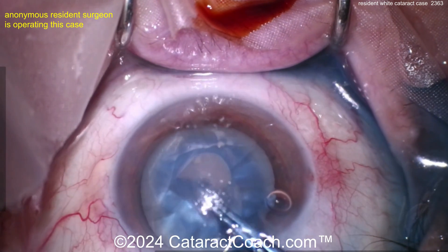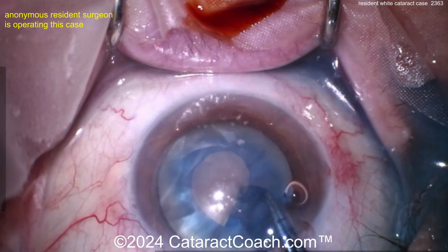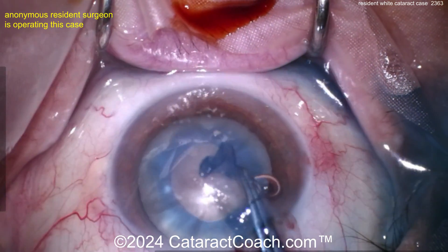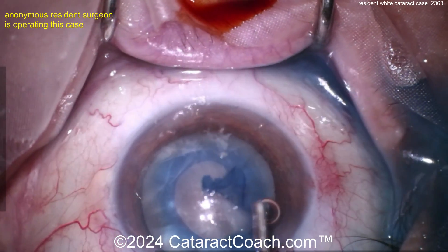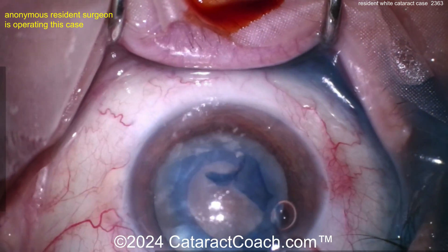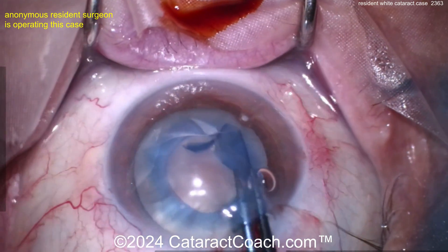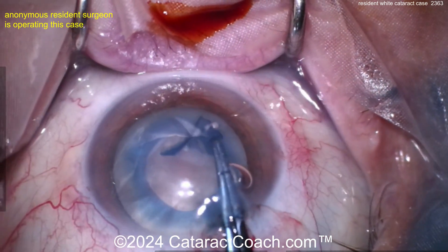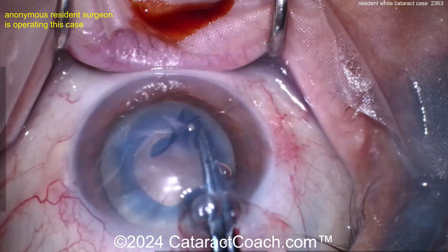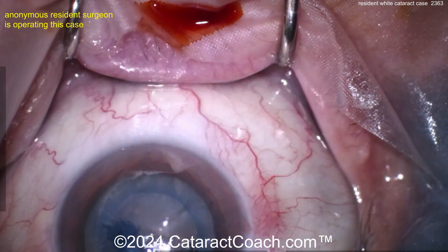Look at the forceps — our surgeon is using some very nice marked forceps so you can tell the size of the rexis as you tear it. Unfortunately this is looking a little bit on the small side. It's still okay — you can still do a great job even with a four or four-and-a-half millimeter rexis. Here comes some viscoelastic going inside the eye; I wouldn't inject it underneath the capsule, I'd put it on top. The rexis looks pretty good; I'll give you points for a continuous curvilinear round rexis. I just think you'd have an easier time if it were a little bigger, but this is still fine.